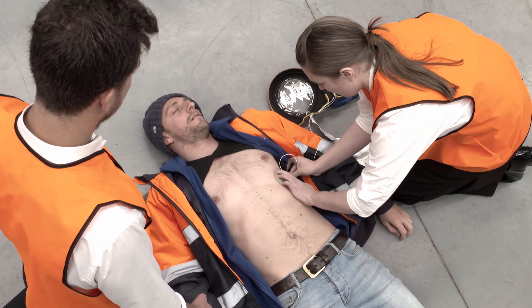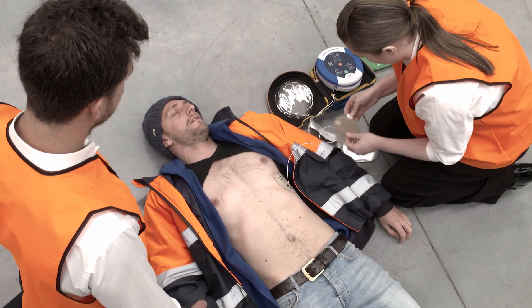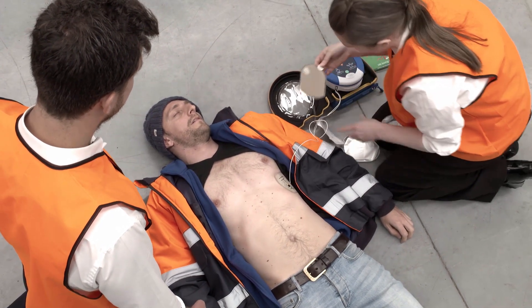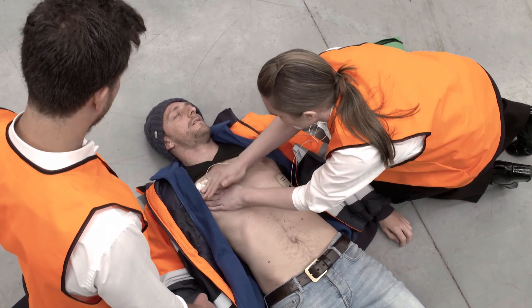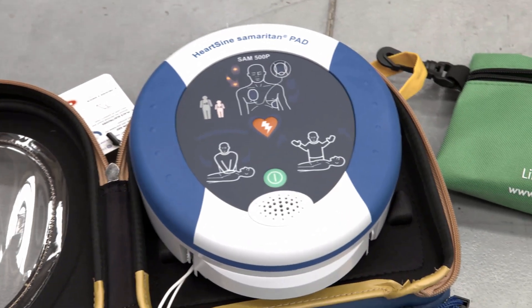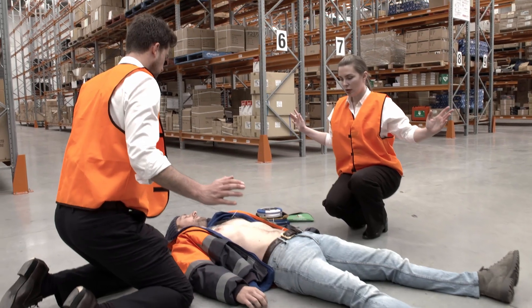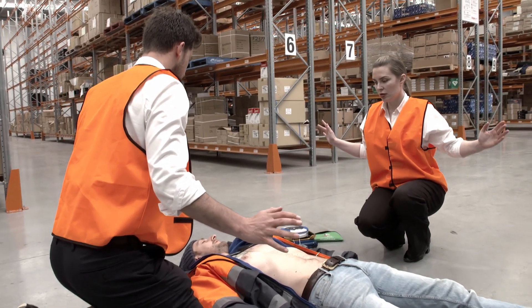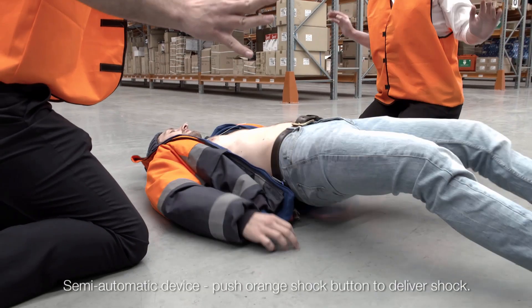The 500P will start to analyze the heart rhythm of the patient and instruct if a shock is advised. The semi-automatic 500P will prompt the rescuer to deliver the shock by pushing the orange button. Analyzing — do not touch the patient. Shock advised — stand clear of patient. Press the orange shock button now. Shock delivered.